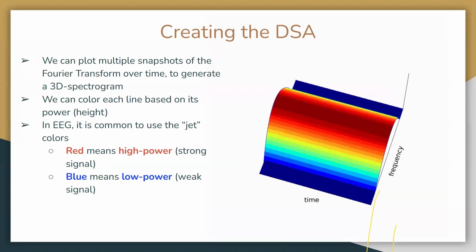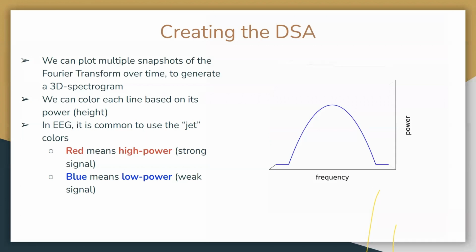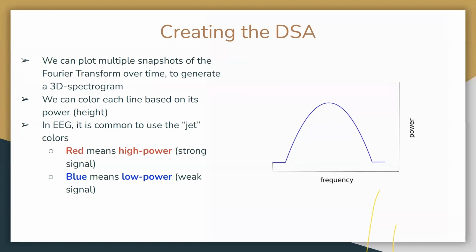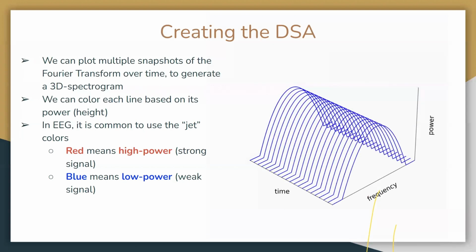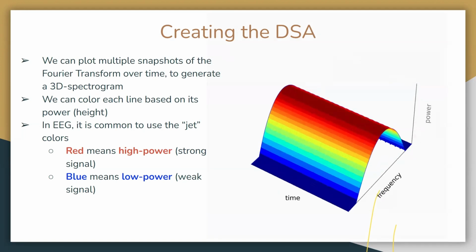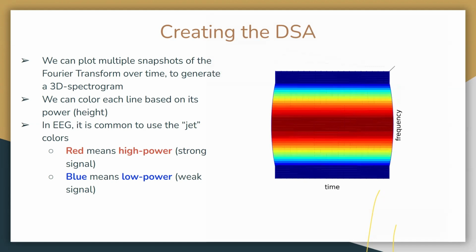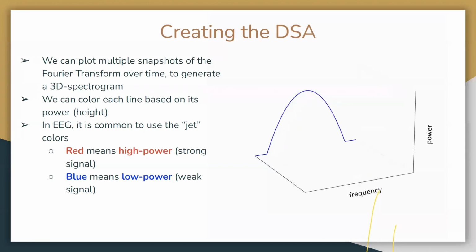And because it's colored, I can look at the data from the top down. By looking at it from the top down, you can see in that image that some of the data is hidden behind the contour of that plot. So by viewing it from the top down, I can see everything without having to rotate it. Viewing it with color representing the third axis means you don't have to interact with the monitor to rotate things or adjust to get a better image. It lets us just have a top-down view.